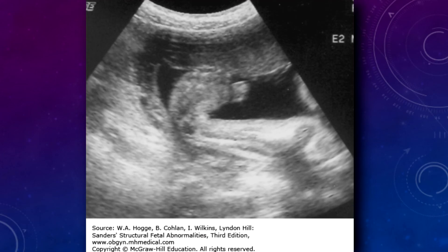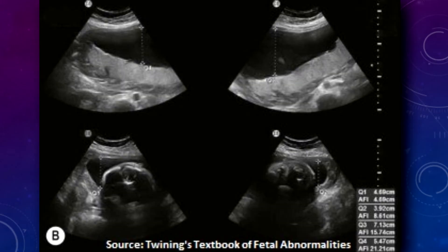Once you're done with your fetal exam, you can continue on to the amniotic fluid. The amniotic fluid can be completely anechoic or can sometimes have echogenicities called vernix. You want to measure the amniotic fluid and take what's called an amniotic fluid index. You divide the uterus into four quadrants and measure the largest vertical pocket in each quadrant, excluding any fetal parts or cord. The sum of those four quadrants gives you your amniotic fluid index.